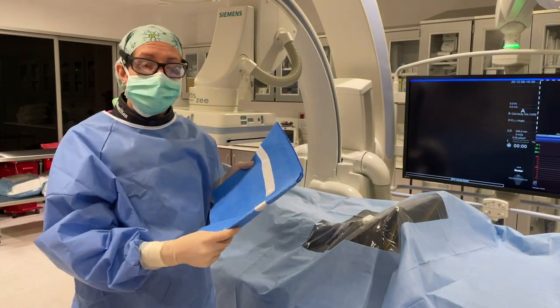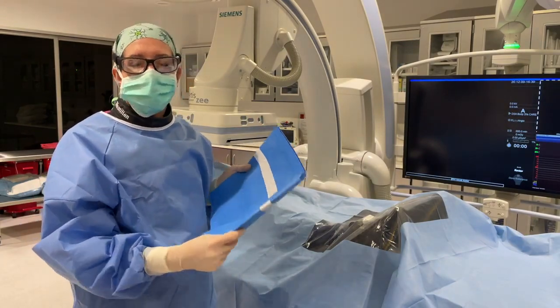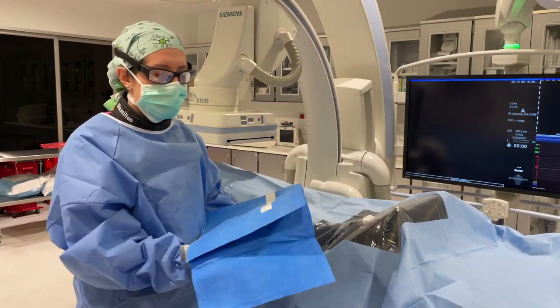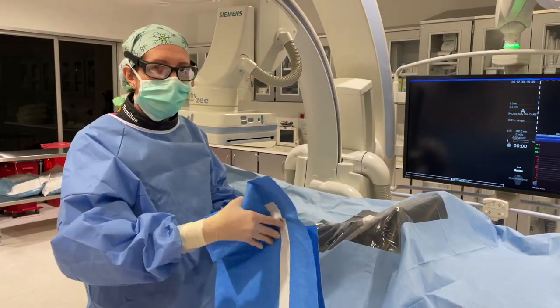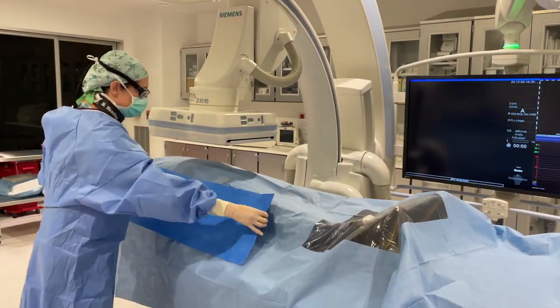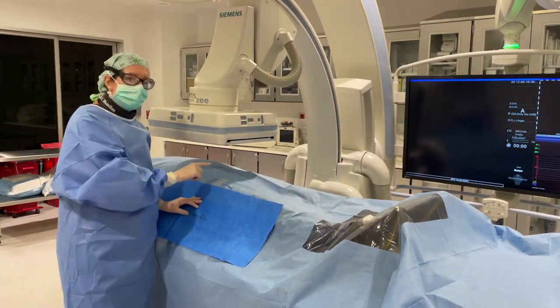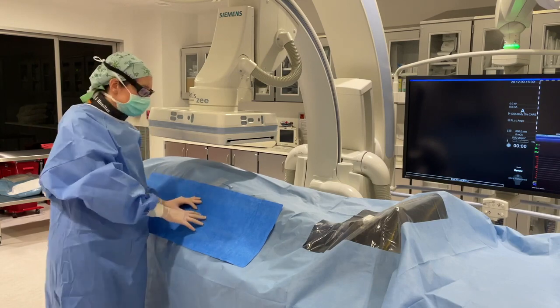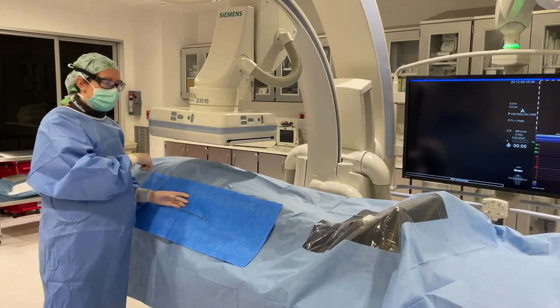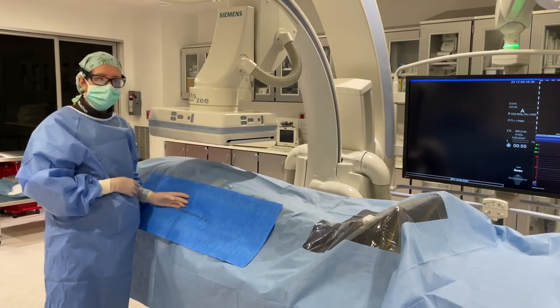For endovascular aortic repair, whether you're working in the thoracic or abdominal aorta, you'll want to use this elongated RADPAD shield, and this will be placed along the patient's trunk and abdomen. You'll place it lateral to your femoral access, and as you can see, this will provide scatter protection from the trunk and abdomen as you work.